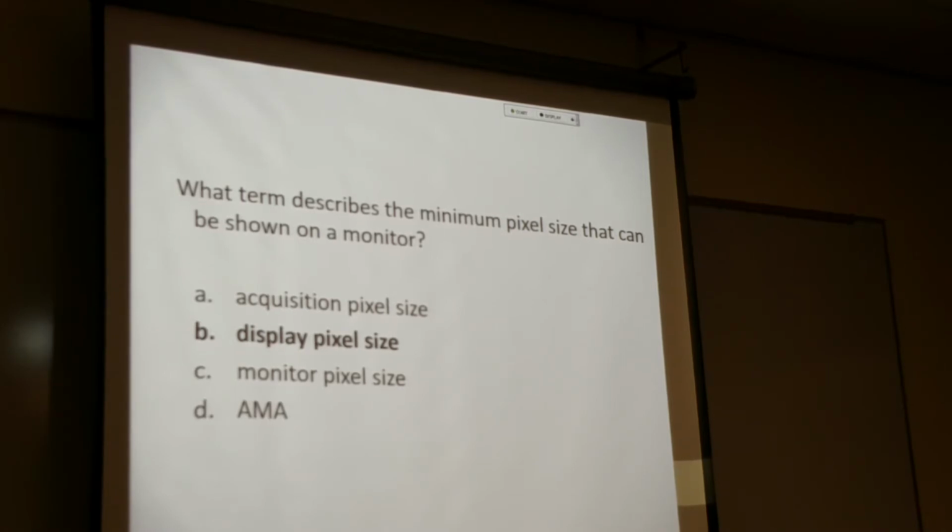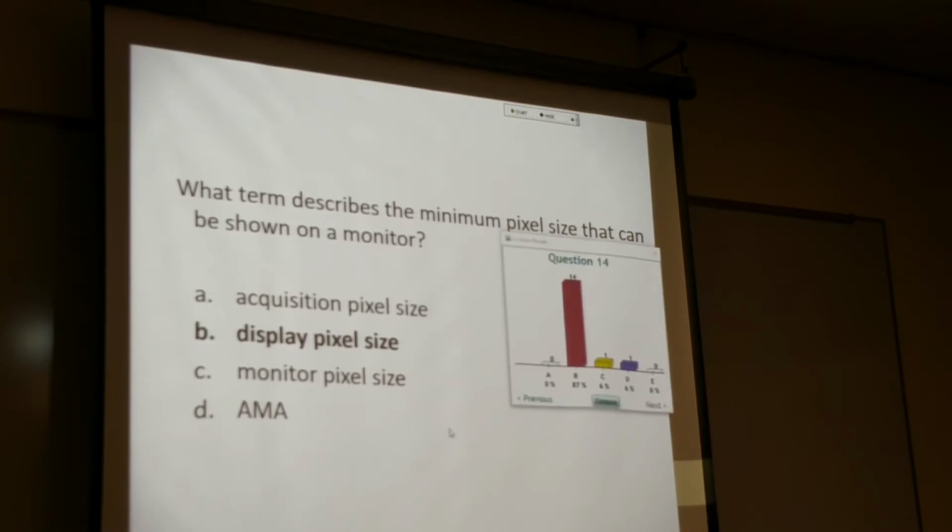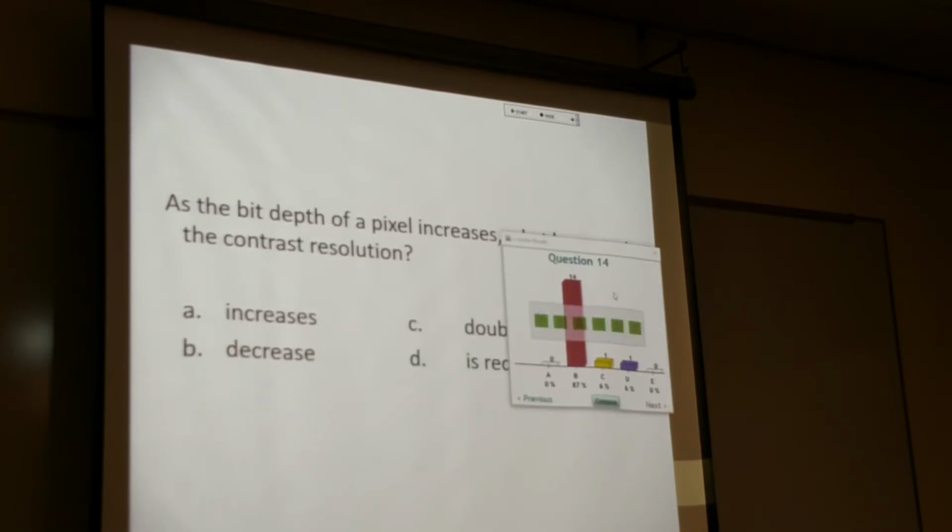Okay, so anytime you see monitor, that is the display pixel size. You might see monitor pixel size, but that's not what we call it. We call it display because it's displaying the image. So most of you got that one.